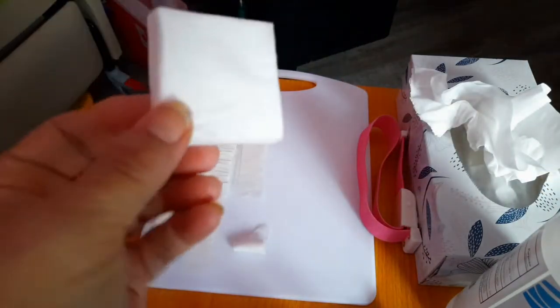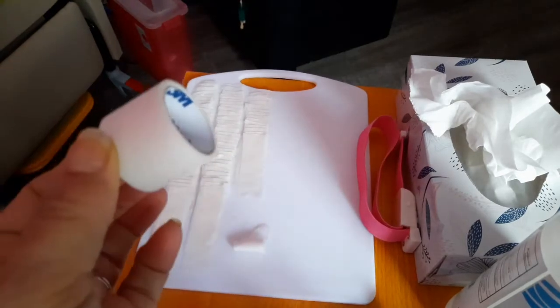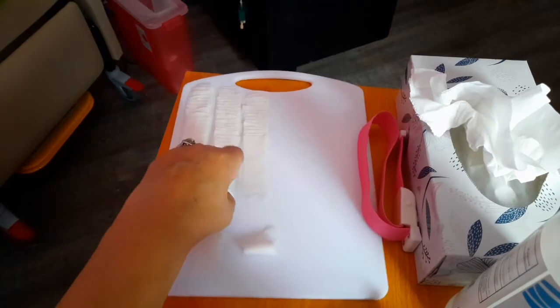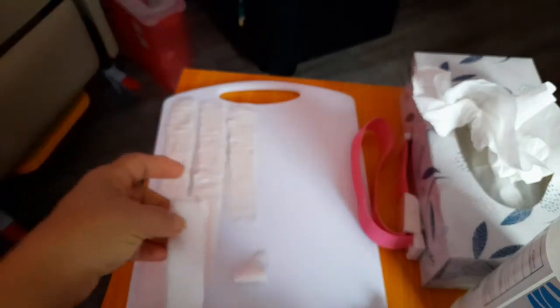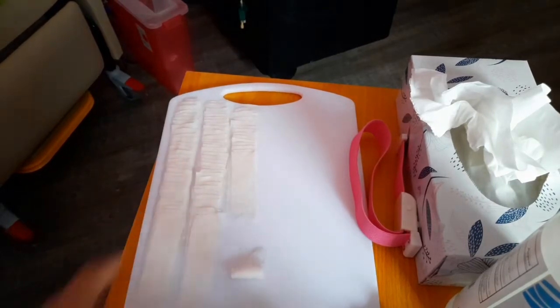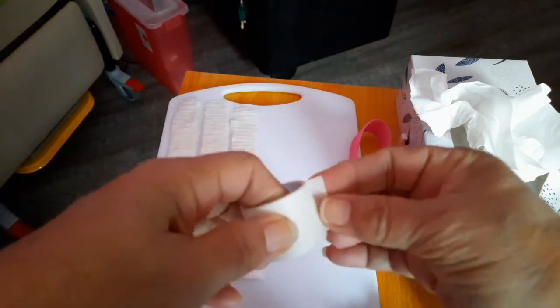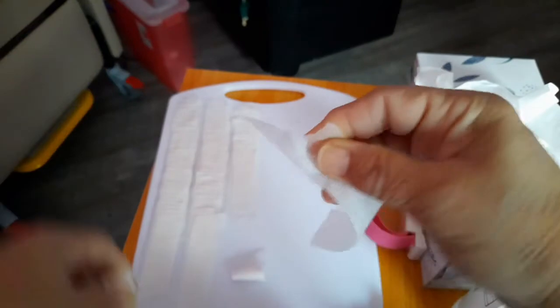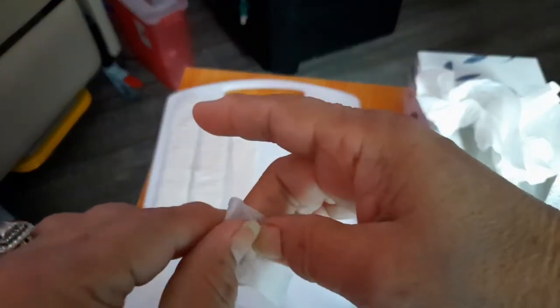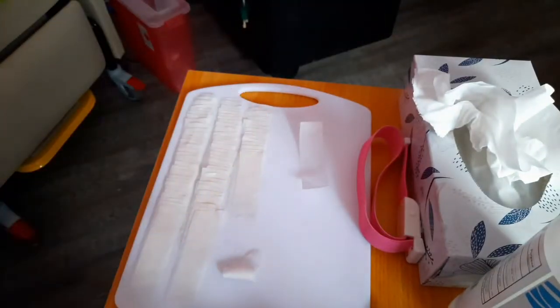Okay, now we're going to get some 2x2s. We're going to get some tape. As you can see, I already have lines or columns of tapes ready. That's for me to seal the gauze on my arm after treatment. So I take the tape, fold in one end, always keep one end folded, pull out about 3-4 inches, doesn't have to be perfect, and we're going to fold the tip on that end. Okay, so that's one, and we're going to do 6 of those.